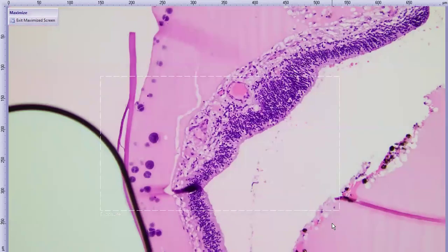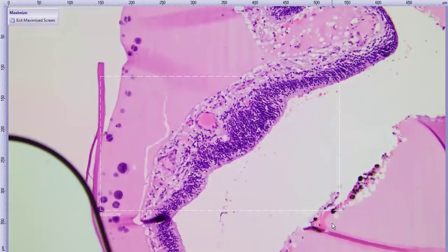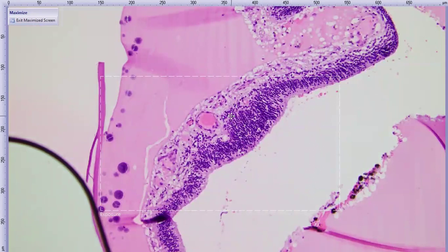So here's recognizable retina. There's definitely retinal atrophy. The photoreceptors are completely atrophied. We know the photoreceptors receive oxygen and nutrition from the choriocapillaris. So when there's retinal detachment, all of a sudden they're deprived of that oxygen and those cells atrophy. So here's the inner nuclear layer. Well, a little bit of the photoreceptors, the inner nuclear layer, and the ganglion cells are also gone.